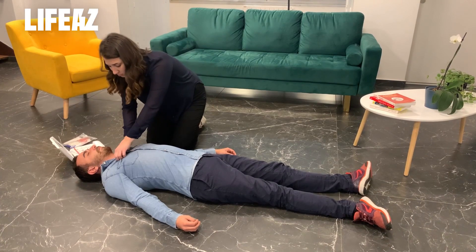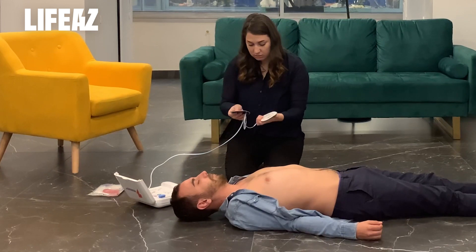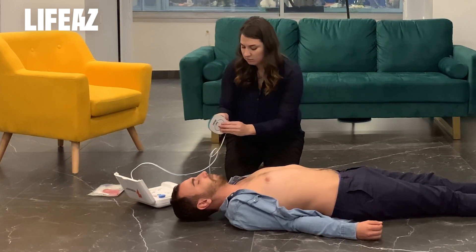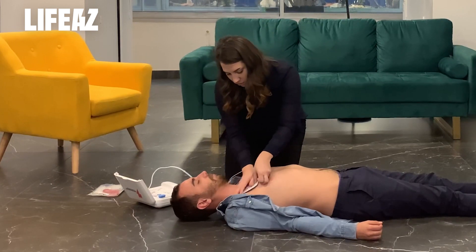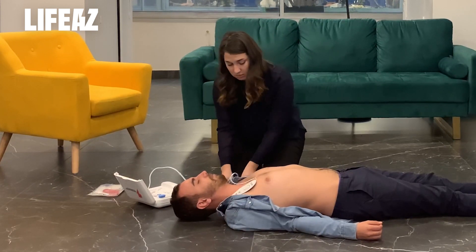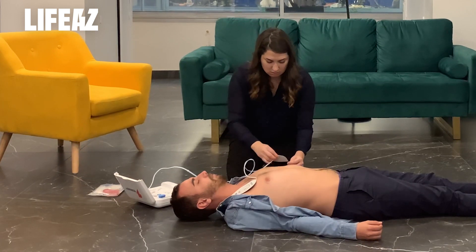Stay calm. Remove all clothes from the victim's chest. Peel pad number one from its plastic liner and stick the pad to the bare skin of the victim, exactly as shown in the picture. Peel pad number two from its plastic liner and stick the pad to the bare skin of the victim, exactly as shown in the picture.